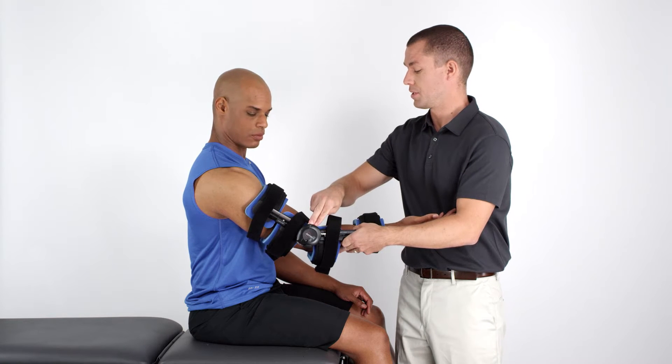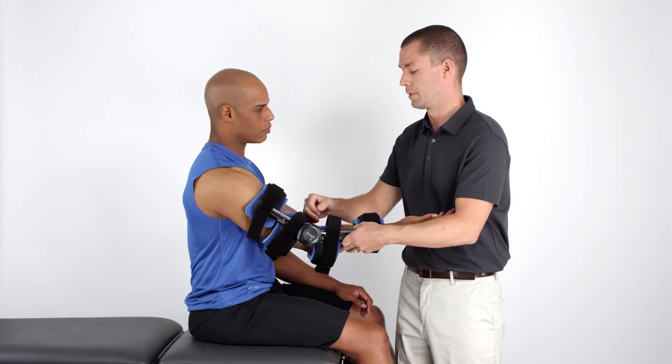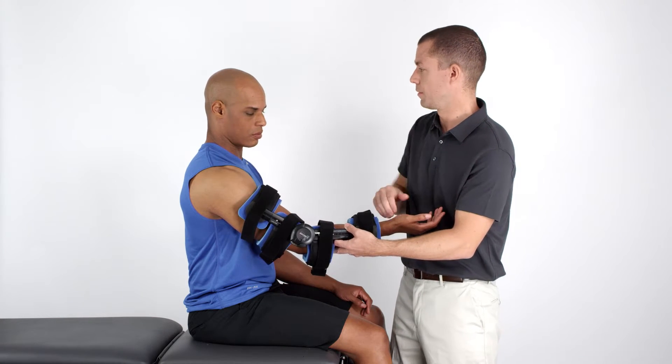Align the device so the center of the tension spring cover lines up with the joint axis of the elbow. Next, align the struts by following the long bones of the arm.